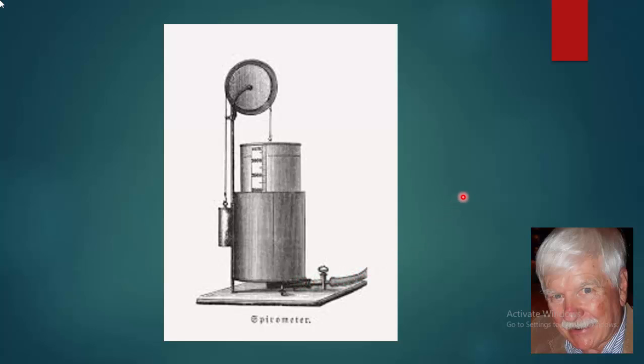That's where the person has the end of that in his or her mouth. And when they blow in, the drum goes up because all the air goes into the drum, makes it lighter, and it goes up. And then as this elevates up, there's a little gauge here that you set to 0, and it spins around, and then it gives you the measure of how much air went into that cylinder.